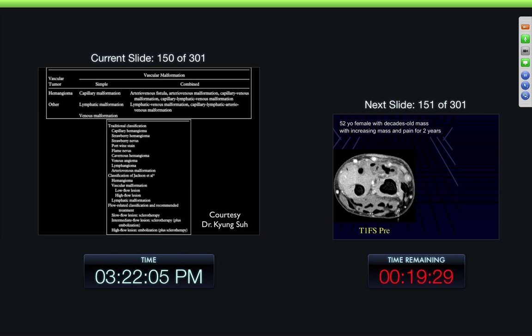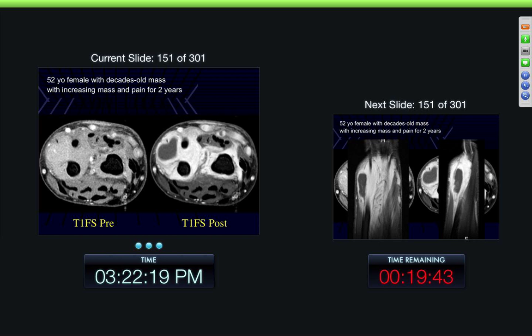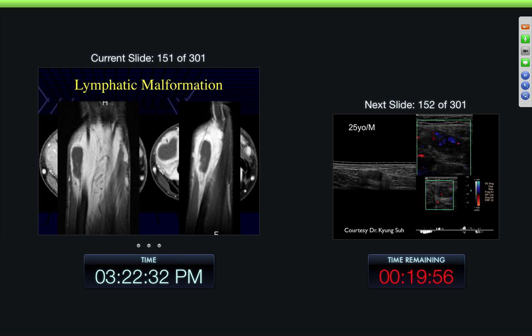This is just a review of the malformations we just talked about. 52-year-old female with a decades-old mass which is increasing in pain for two years. Here we can see a lot of mass, a lot of enhancement, a large area of lack of enhancement. Again, makes you think about a lymphangioma when you see that with this kind of history — large area that doesn't enhance. And this was a lymphangioma.